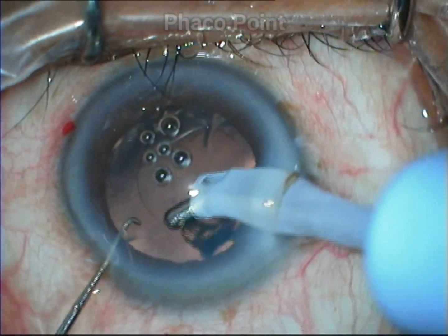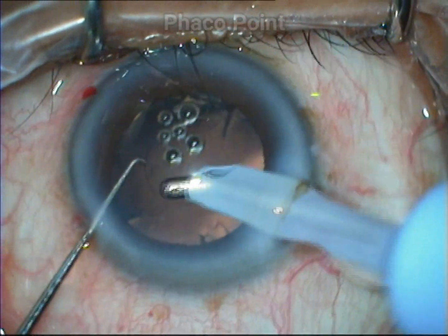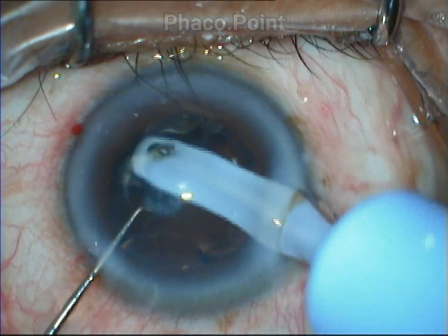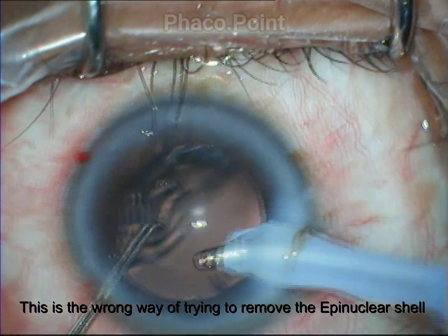The second major problem with the epinucleus shell is that it is totally transparent, and if you are not careful, you may end up missing it, and that could lead to a thick white opacity on the first postoperative day.